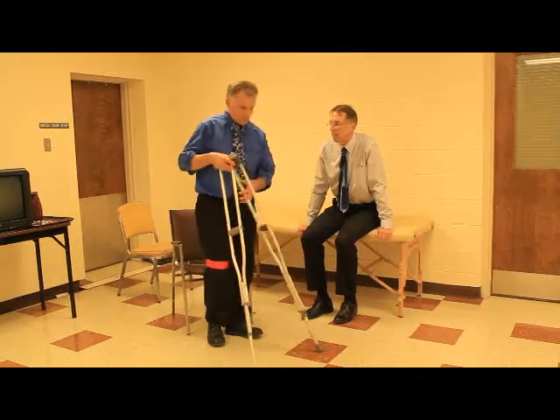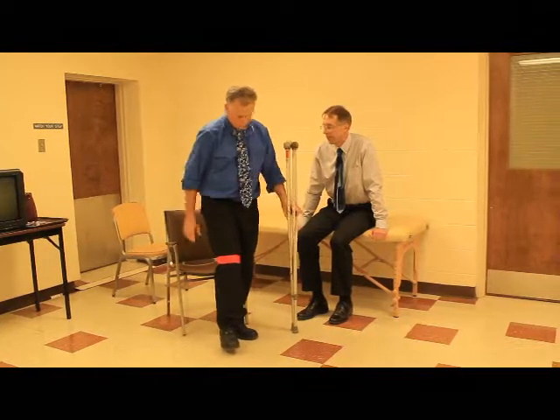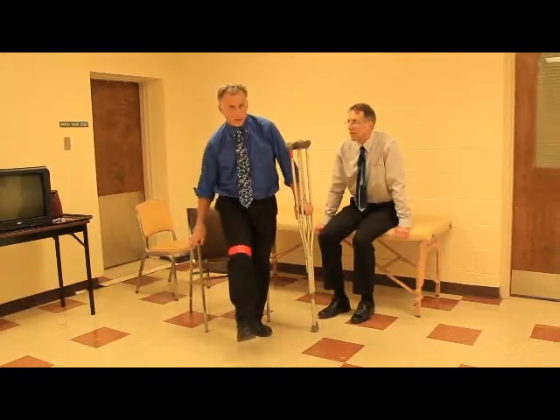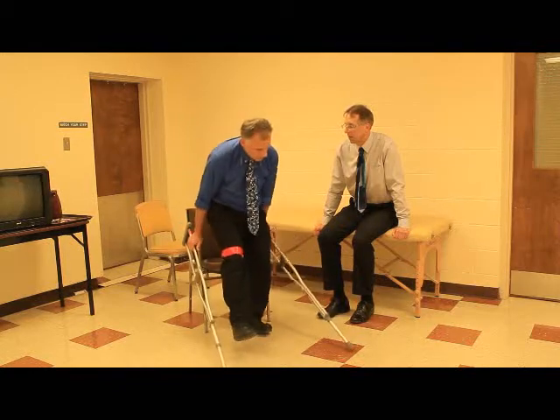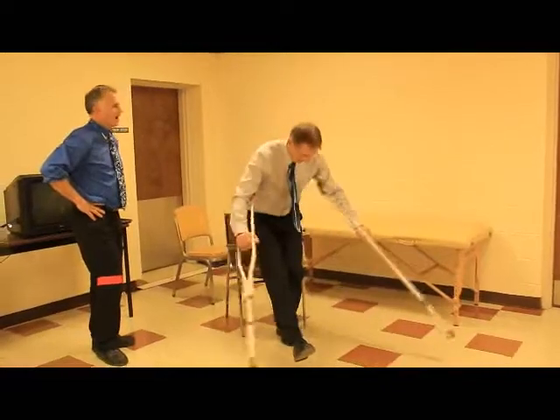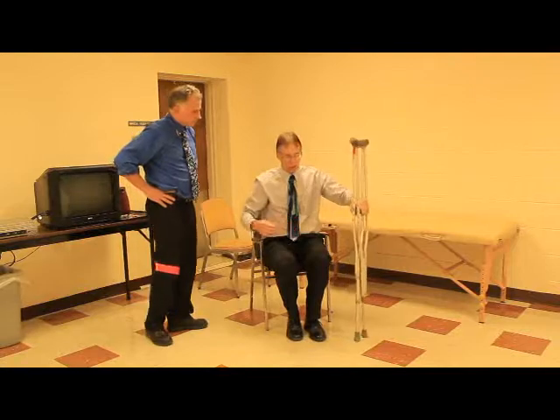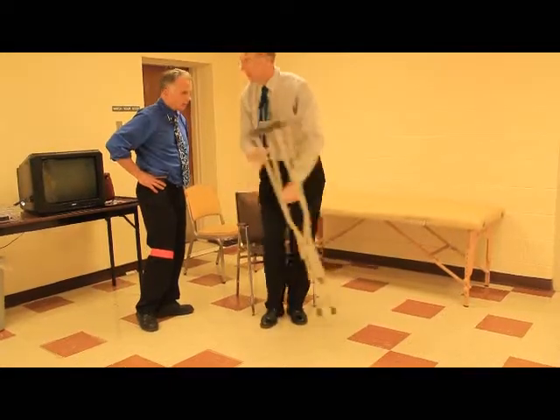How about getting down in a chair with the armrests? This is the way I like to do it — I like to just put both crutches here, reach back for that armrest, and sit down. You can do it getting up that way as we just demonstrated, or you can do it this way too — both work well. What we don't want to see is backing up to the chair and going down that way — this is a disaster ready to happen. So you can either put both crutches on one side here, or put them there. When getting up, you can actually put them both on one side, put the one that's going to give you trouble, and then lean forward — either way will work.